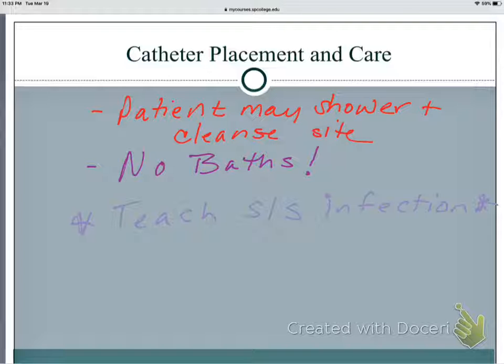And education is really important to teach our patients undergoing peritoneal dialysis, as well as how to troubleshoot. What do you think the biggest complication is with one of these catheters? Infection, absolutely. So we're going to teach them proper hand hygiene. Most of the infections are exit site infections, not from bacteria from the gut traveling. That's really rare. Normally it's exit site infections, so from microbes on our hands, like Staph epidermidis and Staph aureus, those are the ones that are getting these patients.